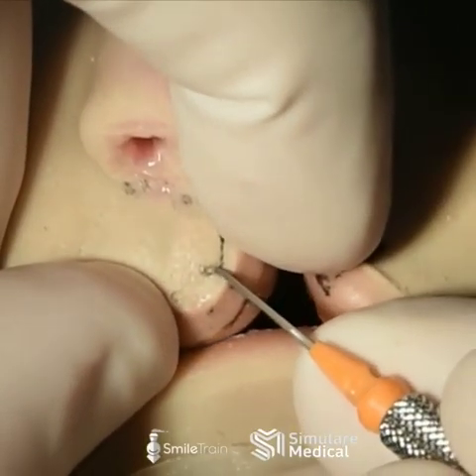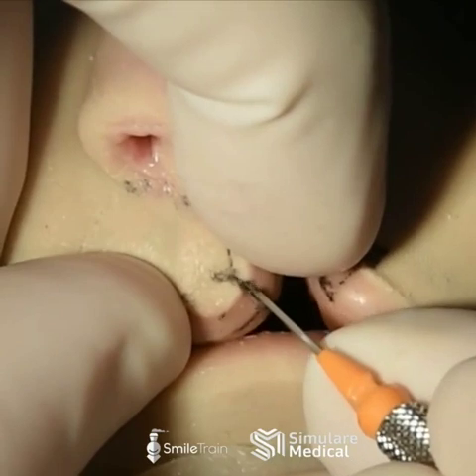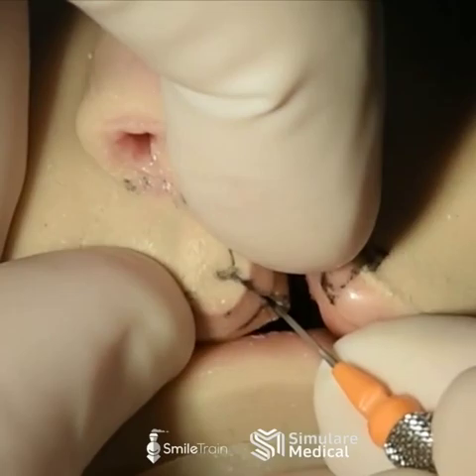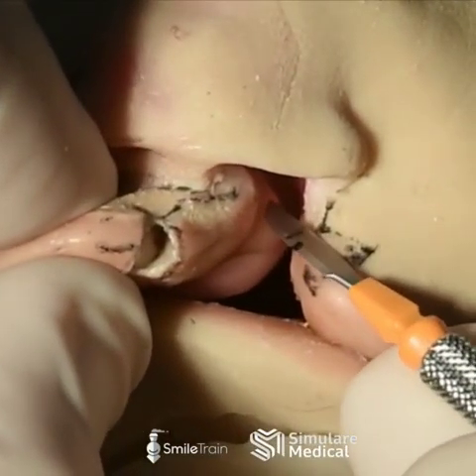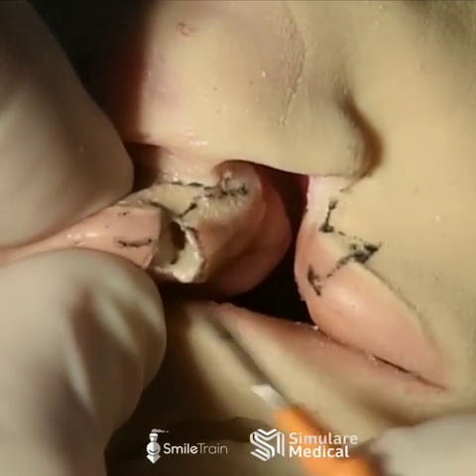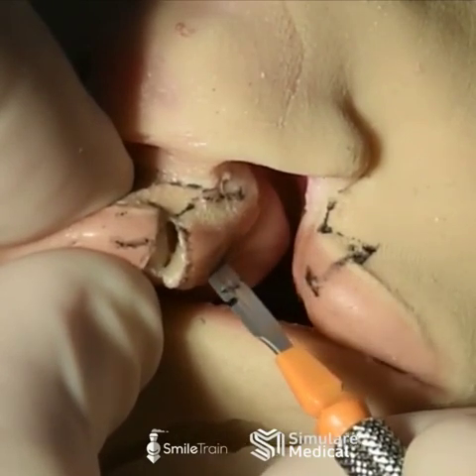It is important to start with the medial lip element. Incisions are made with scalpel and completed with scissors. The vertical mucosal incision is initiated at that point of tension where the mucosa joins the alveolus.